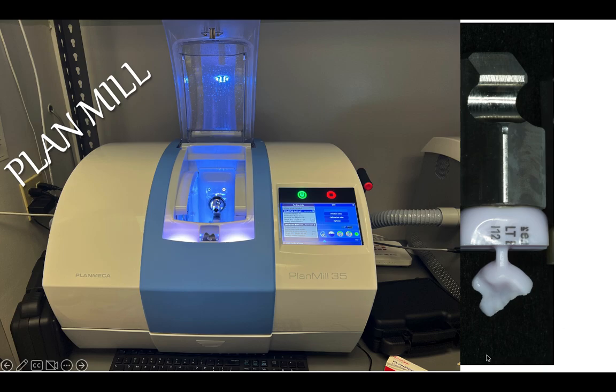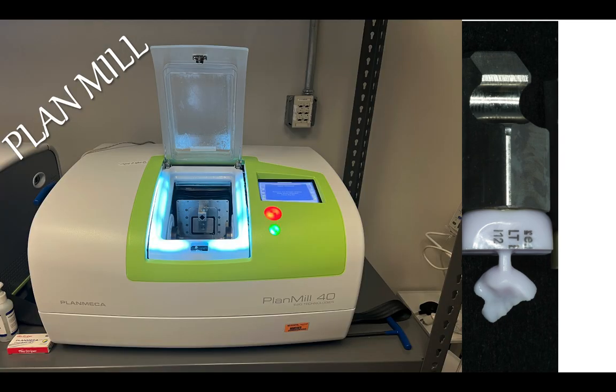And this is for the PlanCAD software, Planmeca's software, the one that we are going to use this coming Friday for you to design your own restorations. You also have a Plan Mill, old fashioned. This is the previous version. They are amazing. They have worked a lot for us, and they are easy to follow. You just need to see the screen and read what the screen asks you to do, and you do what it says.